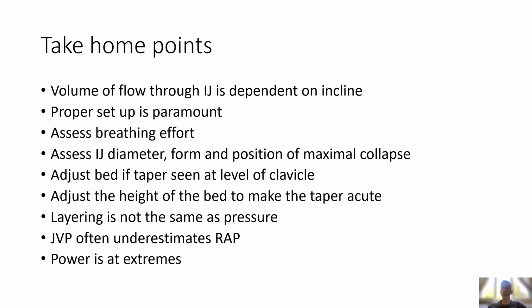Next, layering is not the same as pressure. Layering may be seen if the patient is relatively flat. If the IJ is no bigger than the carotid in the supine position, without the head of the bed at an incline, the appearance of a column is likely not related to pressure and is related to layering.